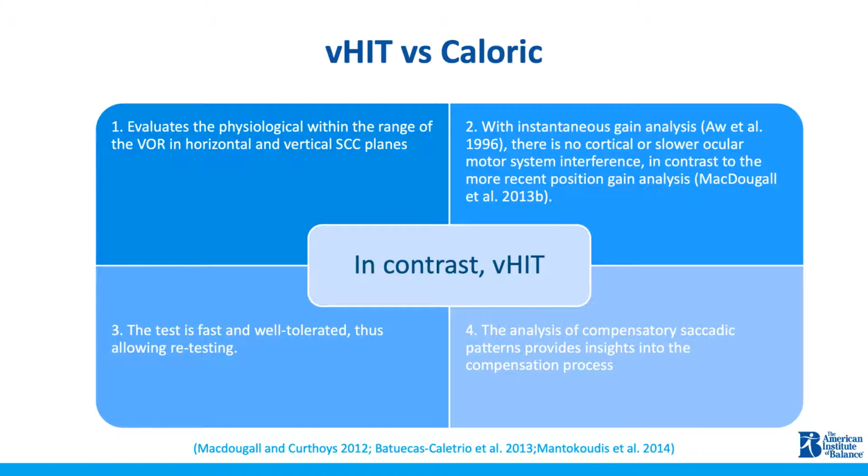So let me take a minute to compare and contrast vHIT and calorics. These tests work best if you're using them to complement and support your suspected diagnosis based on your patient's history, but they do both have a role in this patient's case.